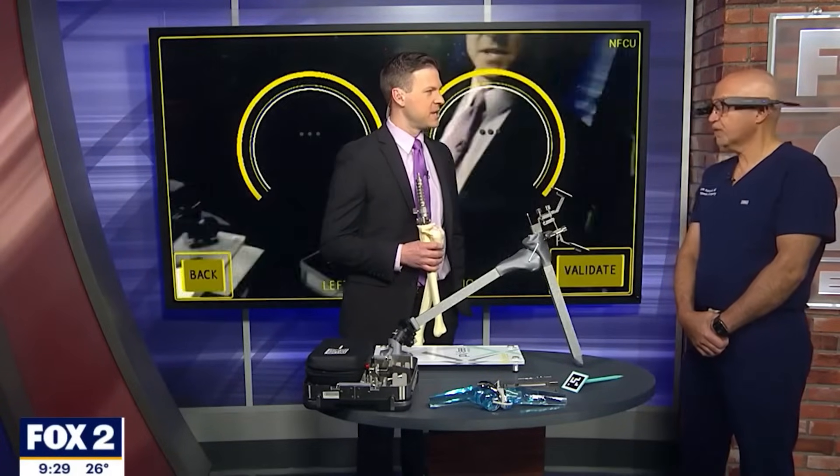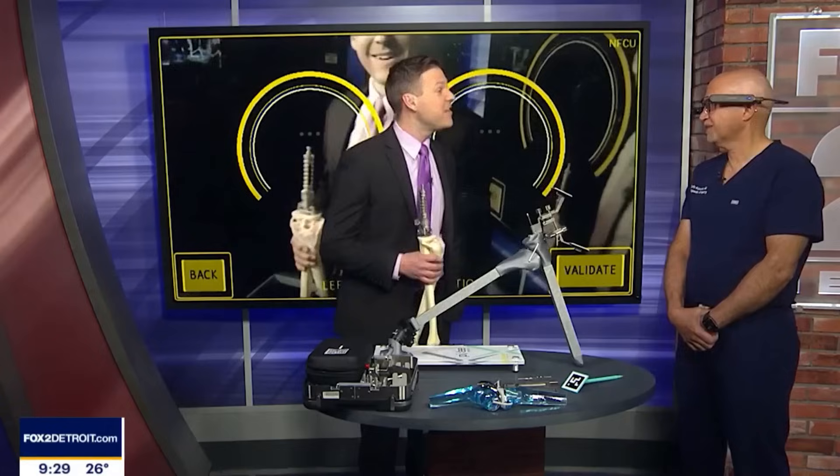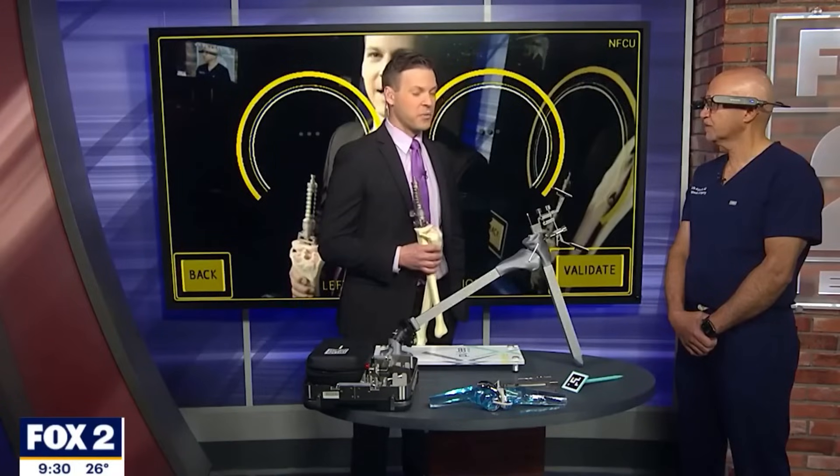There's some shoulder applications coming out from the same company — a company out of France — and they're able to show you that anatomy through the glasses without having to get into the patient. We're the first and only in Michigan, Trinity Health Oakland. There are only about five sets in the United States at this point. It got FDA approved about two years ago, and we started using it about eight months ago. Trinity Health Oakland is ahead of its time and invested the resources to bring this equipment to St. Joe's, and we're seeing the results already.